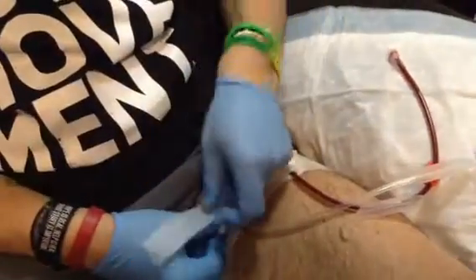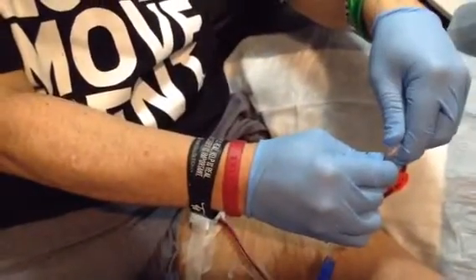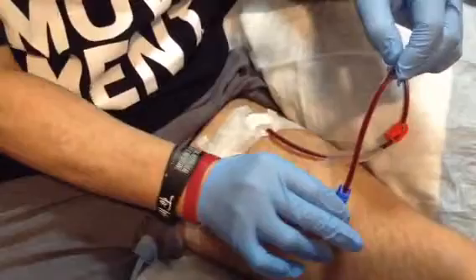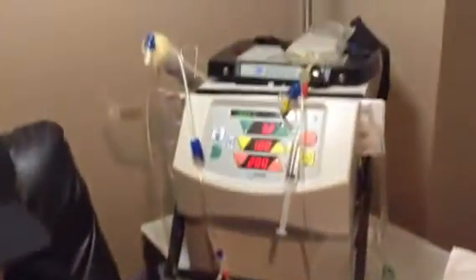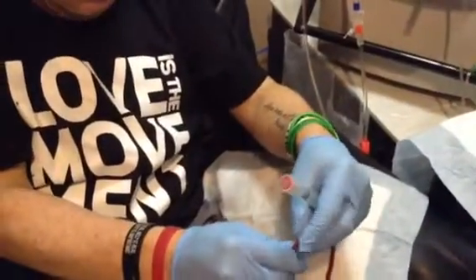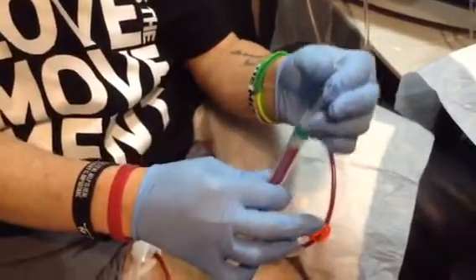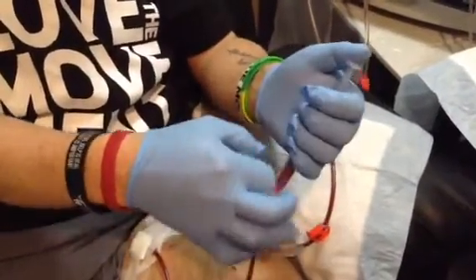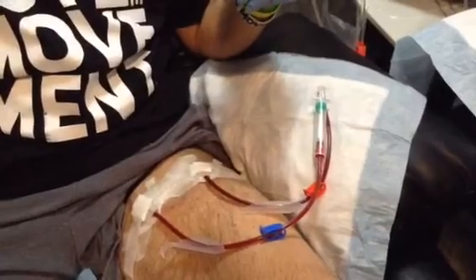I take this and tape it, then slide that down. You loosen it a little bit to bring the blood all the way up to the end, then close it. The blood is going back in — it comes out here, goes to the machine, and then comes back through the blue line into me, cleaned out. First though, I take this — this is heparin — so I don't clot up. I make sure there's no bubbles and the flow is good before I start.